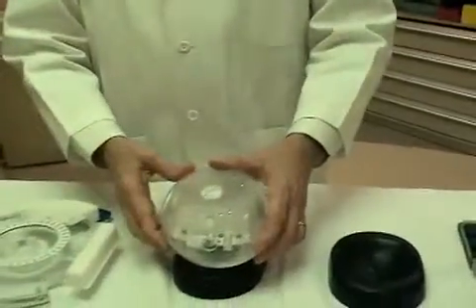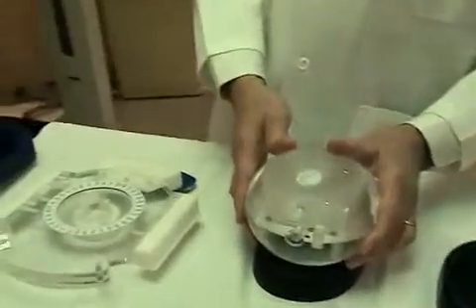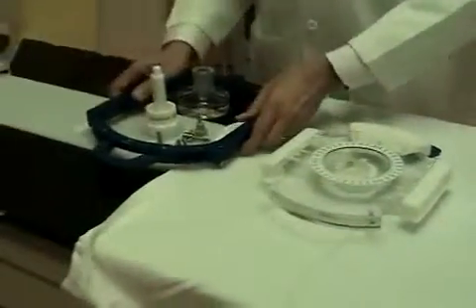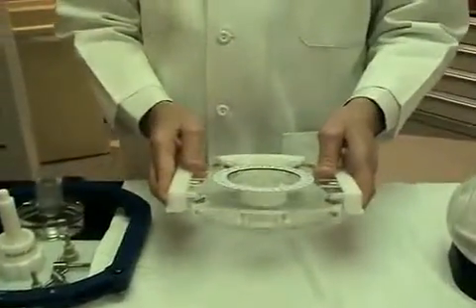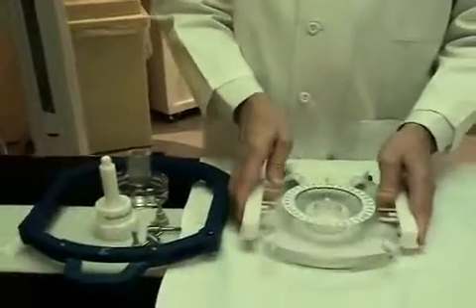Once you have your Lucy Phantom assembled for the scan, you need to attach it to the head frame. Here I've got a BrainLab head frame and a Lucy BrainLab interface. There are other interfaces available depending upon which kind of head frame you use.